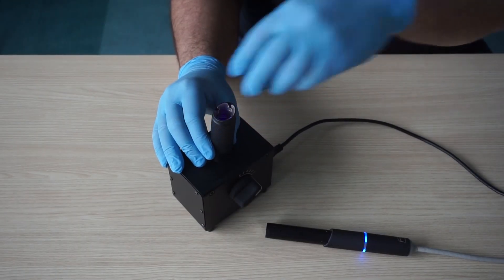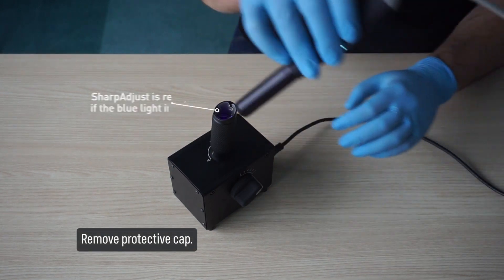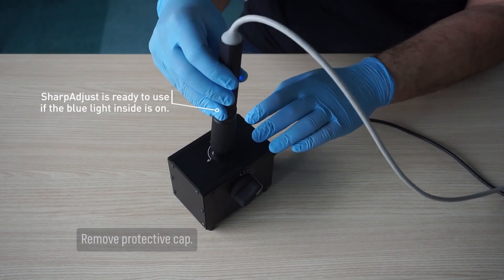Remove protective cap. Sharp Adjust is ready to use if the blue light inside is on. Slide handpiece in and click into position.